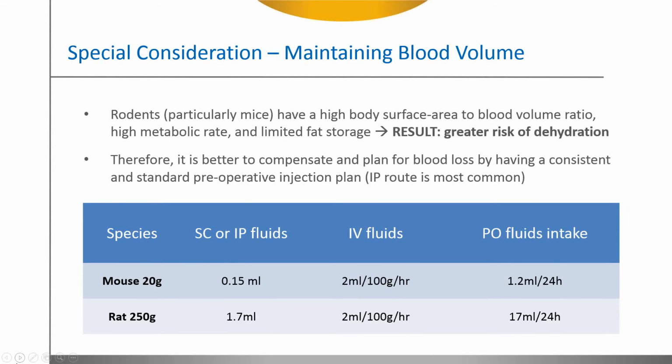So before you insert the catheter, you understand that the right carotid artery or open chest has to be open and the heart has to be stabbed through the apex. So you will lose the blood. You will eventually lose blood during this procedure.